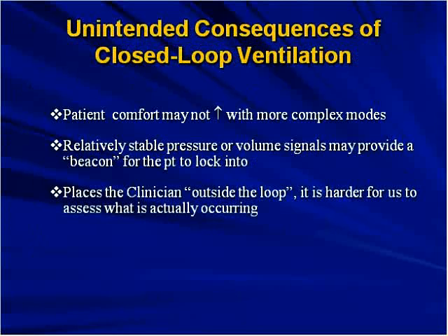The first question that came in was, how do we assess peak flow and inspiratory time when in a CPAP mode?